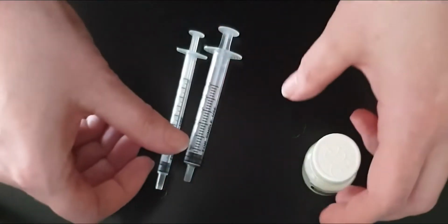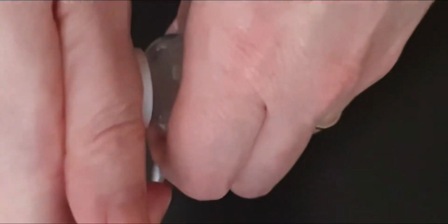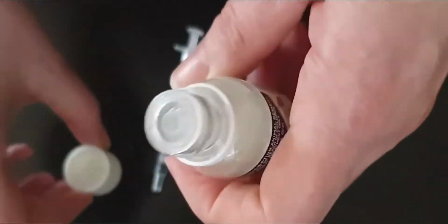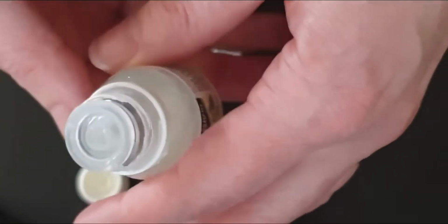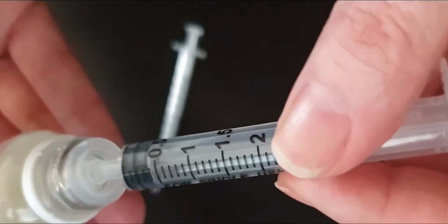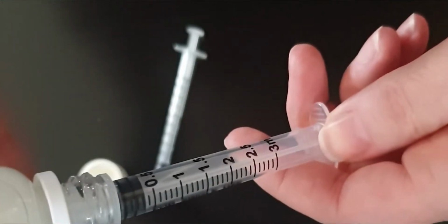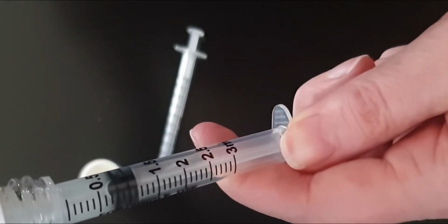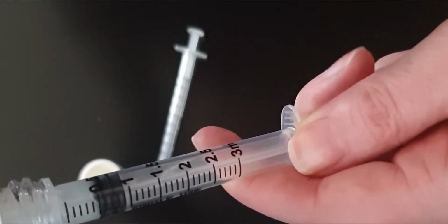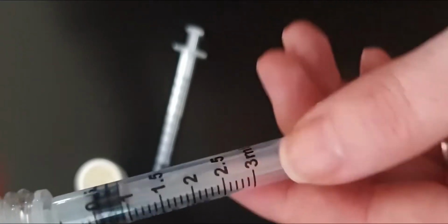Most medications that we'll give are going to be a liquid in a bottle a bit like this one. You just unscrew the top. There's a little port at the top here that is designed specifically to fit these syringes. So to draw up a medication, you would poke the top of your syringe into that hole there at the opening of the bottle. You can turn the whole thing upside down, and you can pull out exactly the amount that you need. If you go past where you need to be, just push it back in. So that's 0.5 mils of this medication.